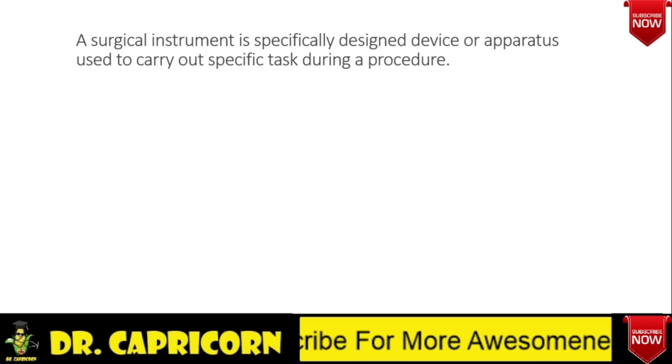What do you mean by a surgical instrument? A surgical instrument is a specifically designed device or apparatus which is used to carry out a specific task during a procedure.